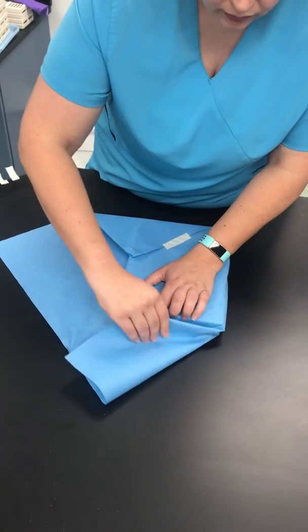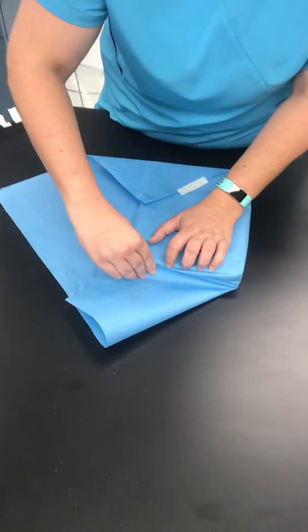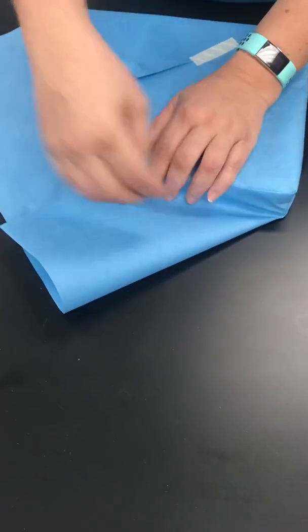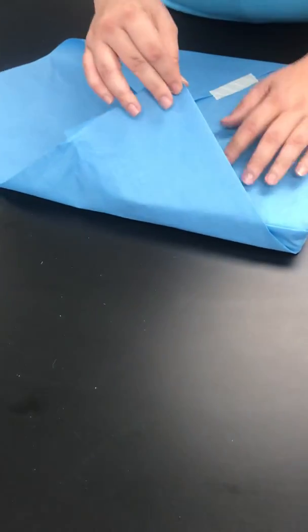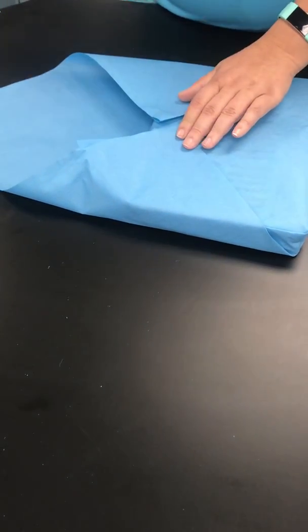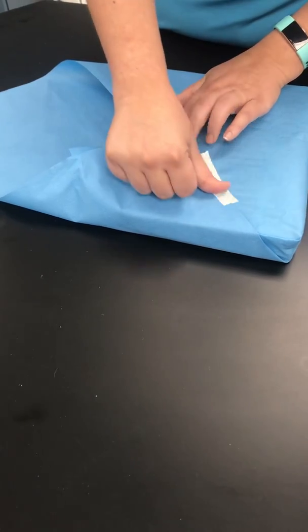So fold it over, hold it towards the top, make your crease, fold the wing all the way over, and place a piece of tape towards the middle.